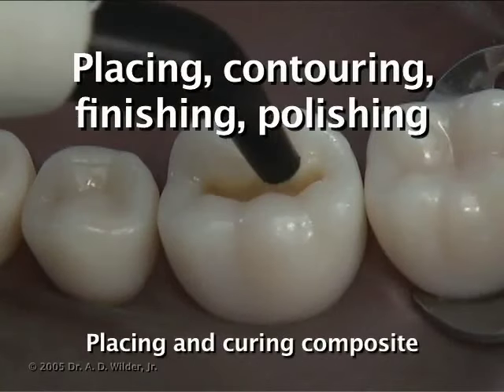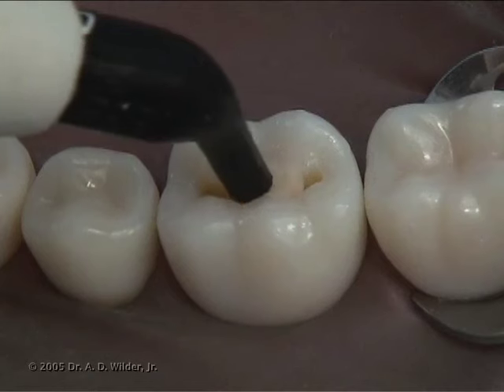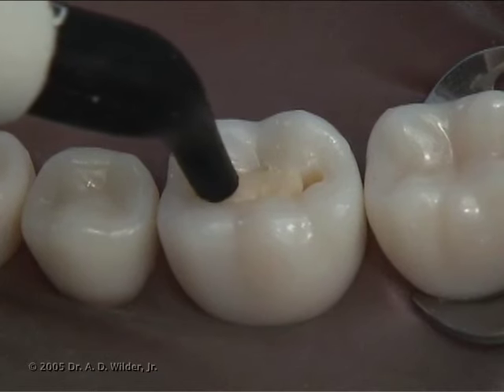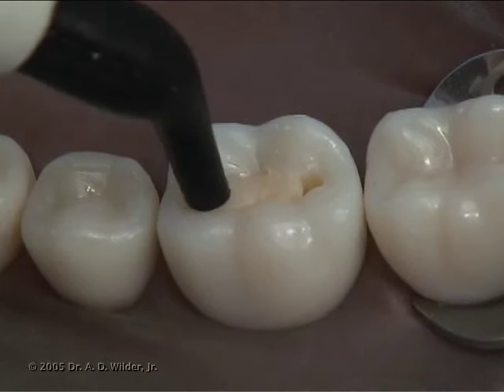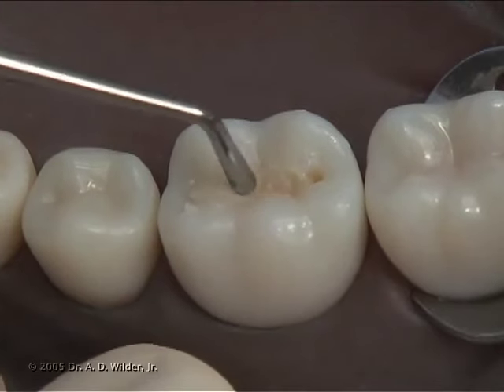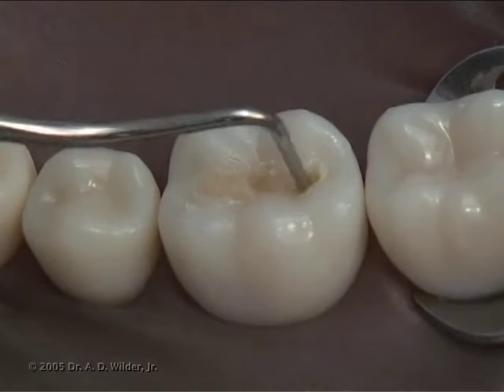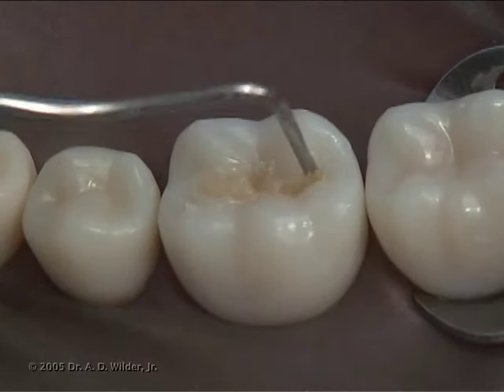Place the composite via a composite gun or hand instrument directly into the cavity preparation. This should be no larger than a 2x2mm glob of composite, unless it's a special bulk fill material. Pack the composite with a blunt hand instrument to ensure that there are no voids along the pulpal floor.